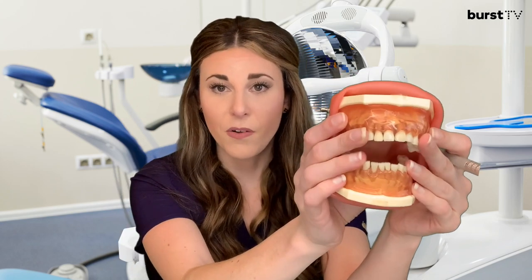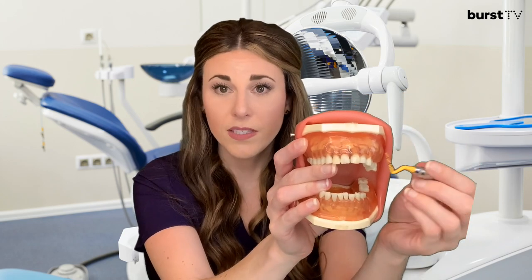Here's how it works. With our mouth model, your provider will use this instrument to just barely slide up underneath that gum line and walk around, recording those measurements. Anything that is one to three millimeters is considered healthy, and anything deeper than that indicates that our patients are experiencing some gingivitis or periodontitis.